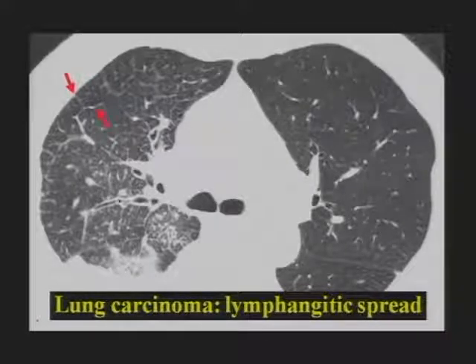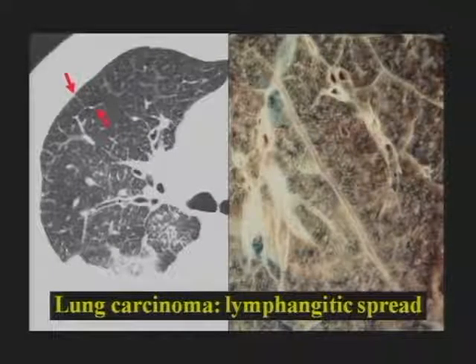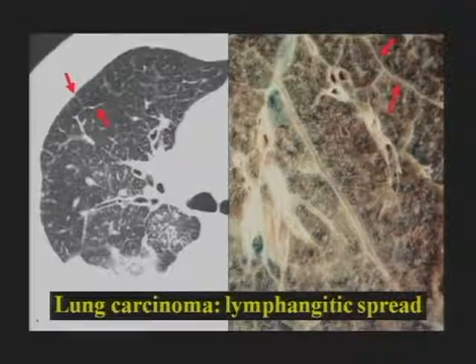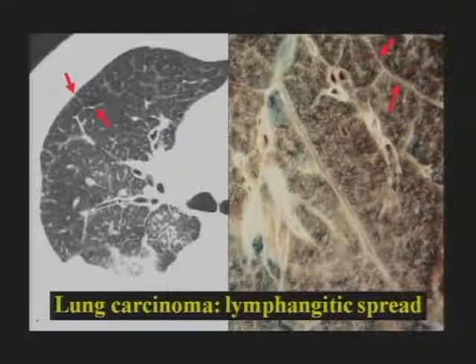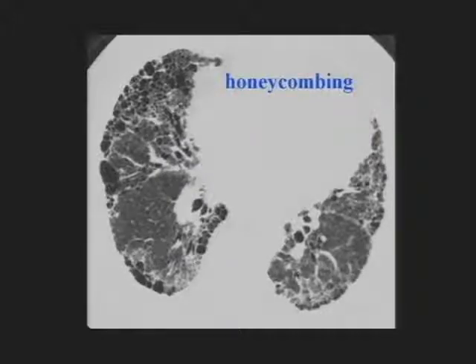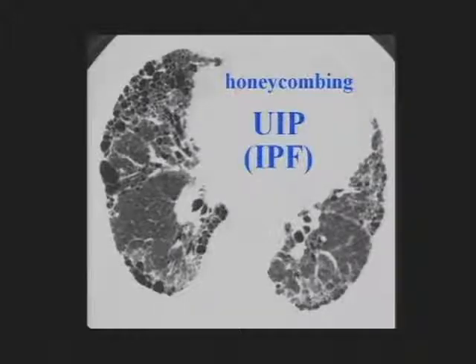This is a patient with lung cancer, and the septa are thickened because of lymphatic infiltration. A lung slice in a different patient with lymphangitic spread of carcinoma shows thickening of the interlobular septa by tumor cells, resulting in this characteristic asymmetrical or unilateral septal thickening. The next finding I'll discuss is honeycombing — another reticular abnormality. This is a very nice example, and this patient has usual interstitial pneumonia, UIP, due to idiopathic pulmonary fibrosis, IPF, which we'll discuss further.